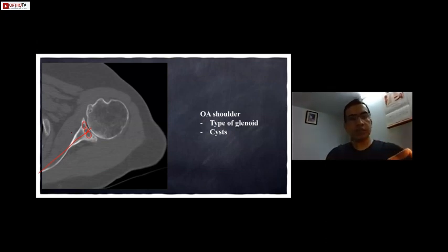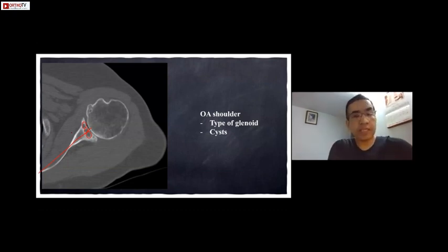Now coming to the CT scan, so dislocations, fractures, or osteoarthritis, I think one of the best investigations is always to have the CT scan. If you have a patient with primary osteoarthritis, but there is a huge cuff atrophy and fatty infiltration, then again, in those cases, you have to combine with MRI, because a mere CT scan will not tell you what's happening to your cuff.